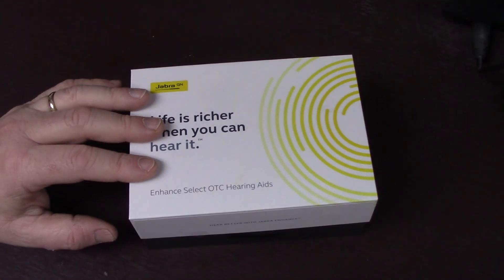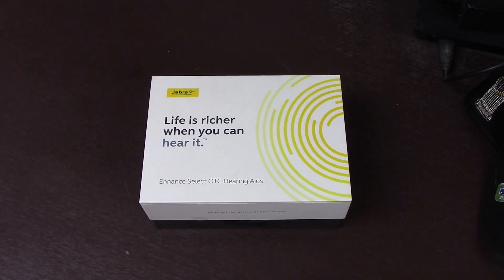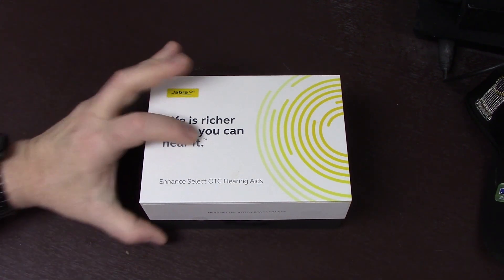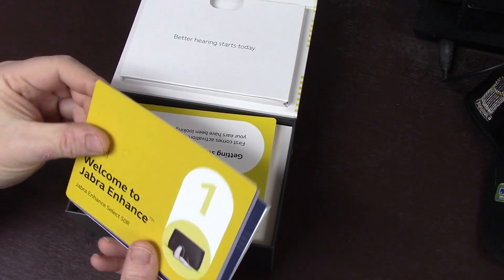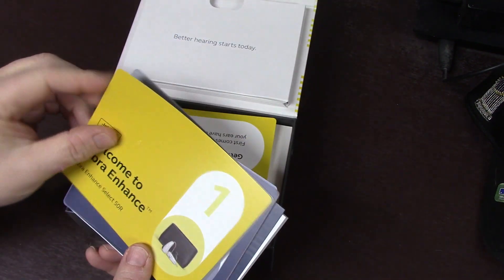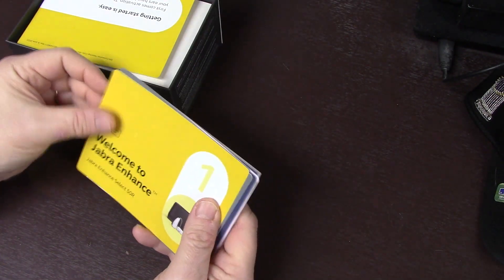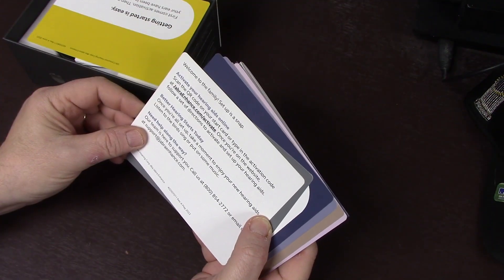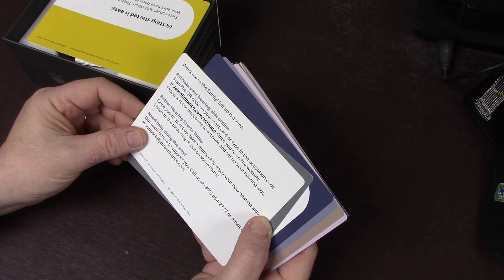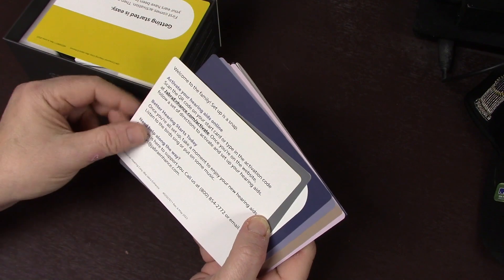Let me back this up so we can unbox it better. Let's dig into this box and see what we got. So we actually have cards to show what to do. Welcome to Jabra Enhanced Select 50R. Welcome to the family. Set up is a snap. Activate your hearing aids online - scan the QR code. Better hearing starts today. It's got a 1-800 number to call if you need help.